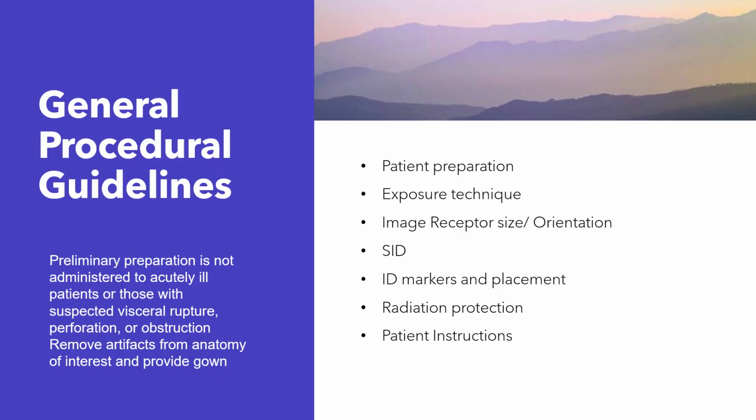Okay? Underwire bra, yeah, that's got to come off. The hooks in the back and the underwire show up on x-ray. Sports bras have such tight elastic that they produce extra skin fold artifacts and affect diagnosis. They also have to come off.